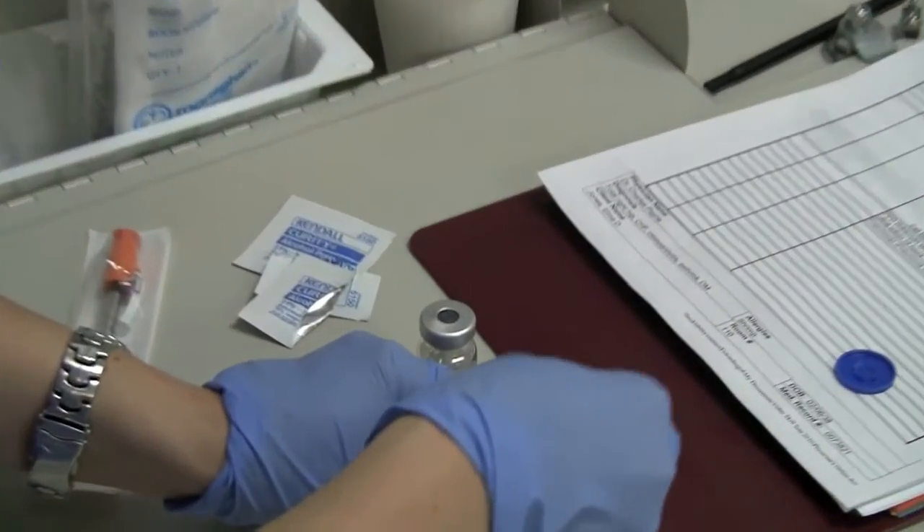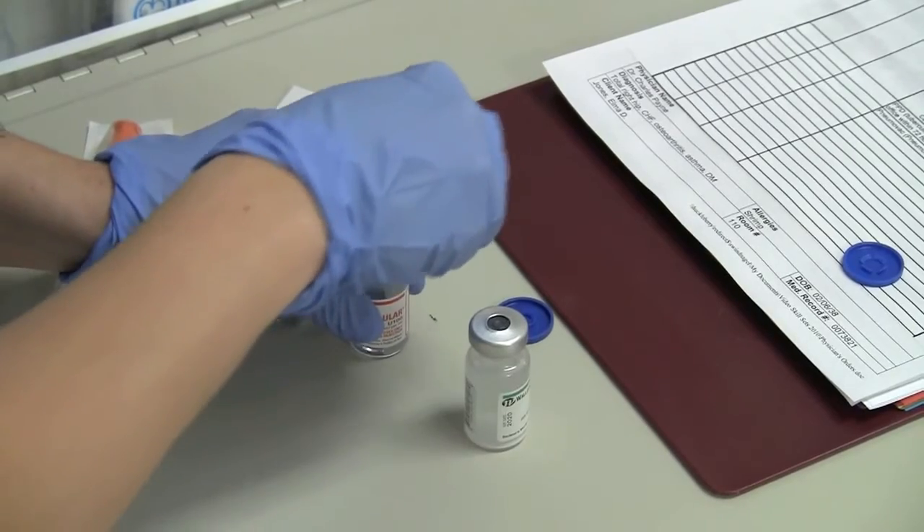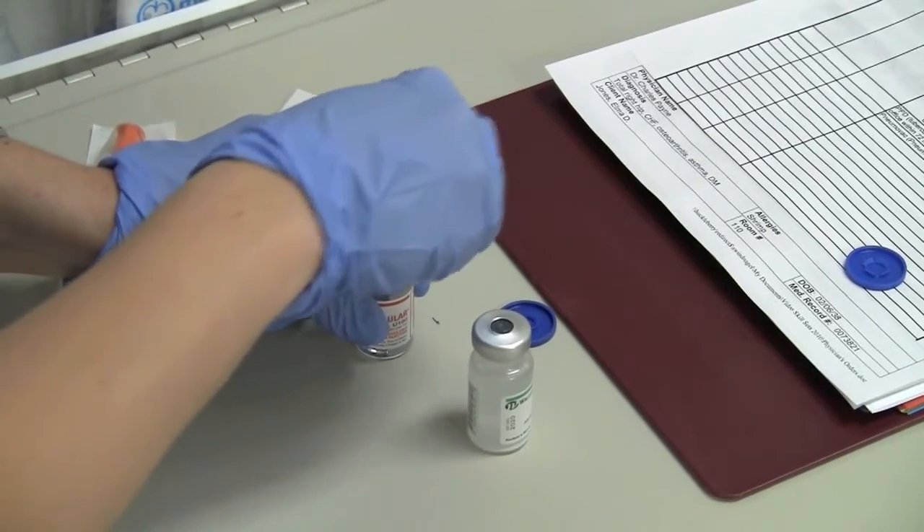Clean the tops of the vials with the antiseptic swab in a circular motion. We'll use the example of mixing 10 units of regular insulin and 30 units of NPH.